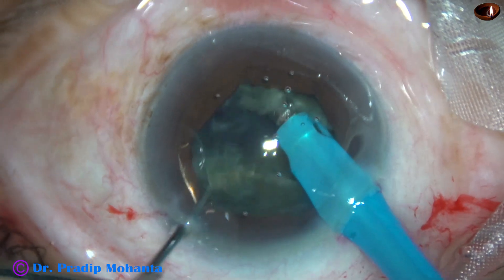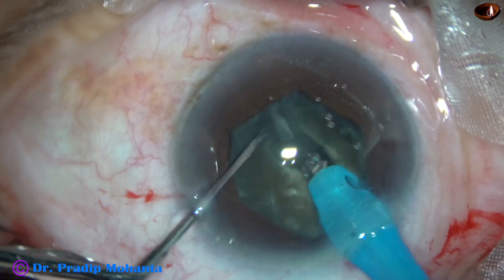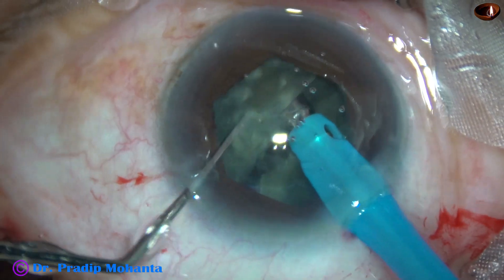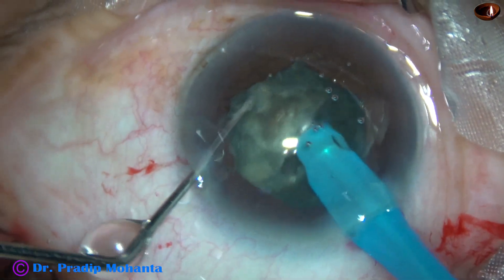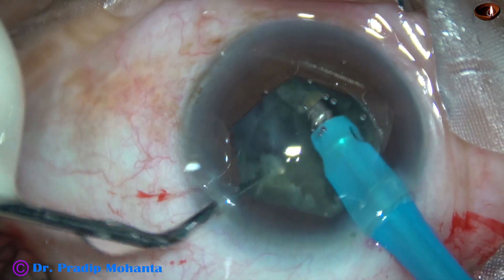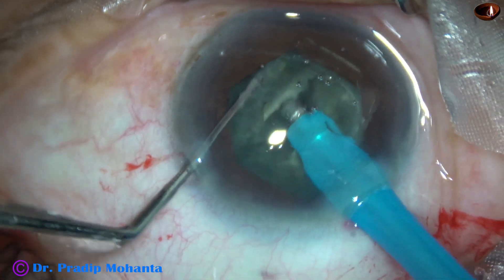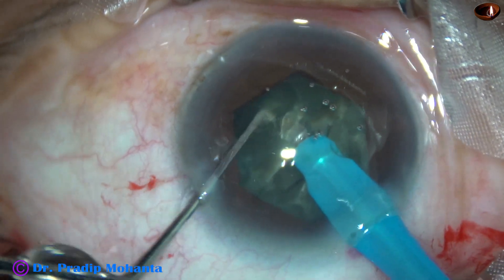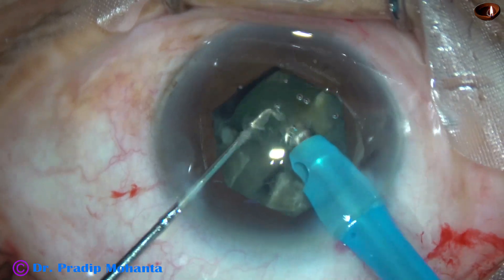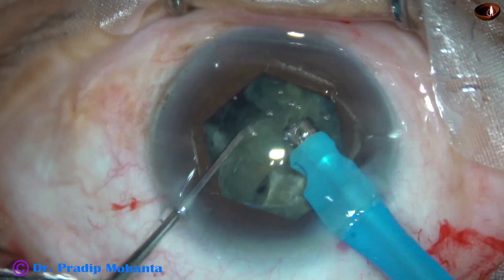We don't have to make a trench. Just go through the substance of the nucleus and divide it into two heminuclei. This is one heminucleus, being divided into two large fragments. Then we come to the other heminucleus, and this is also divided into two large fragments.